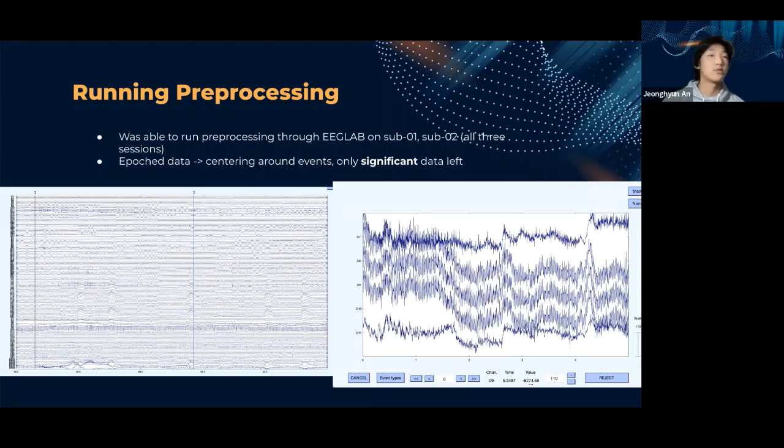That will be kind of hard to see, but it is on the third quarter down. There's a bit of a darker region of the EEG lines. That's channels D8 through 11. For easy viewing, the image on the right is a close-up view of those, and you can see that there's a lot of noise for those channels.